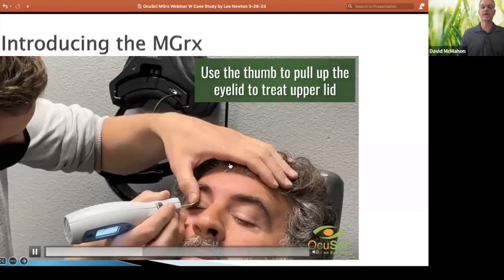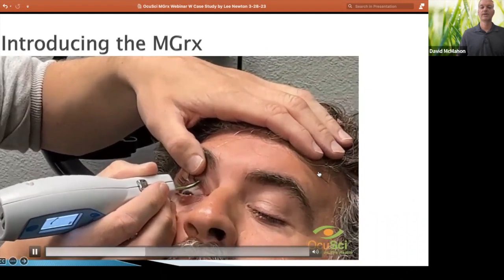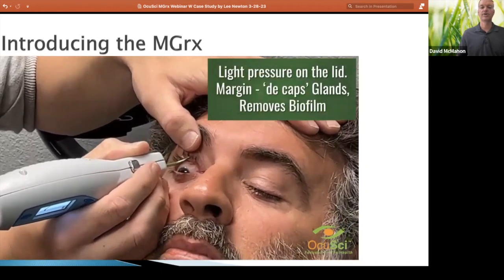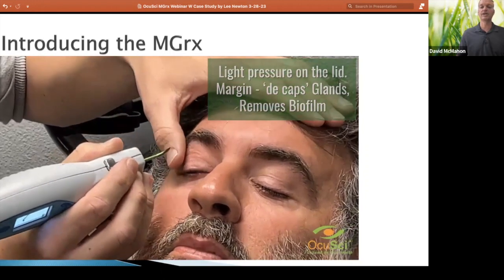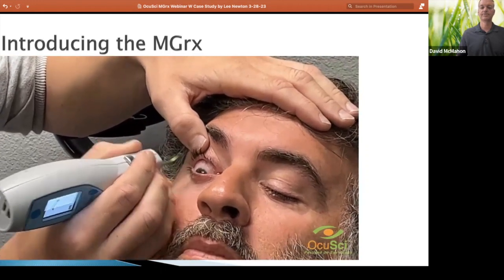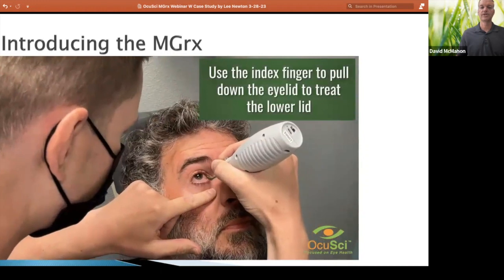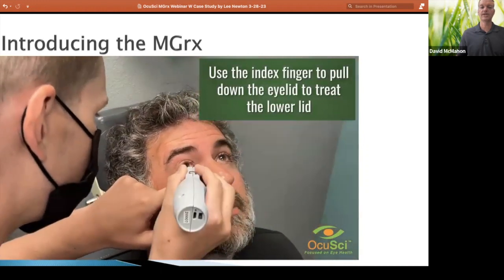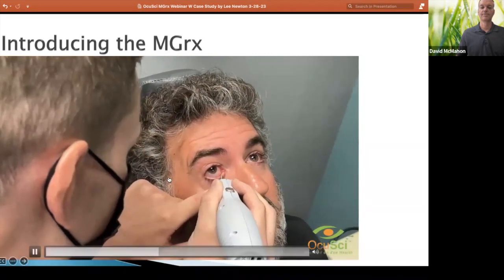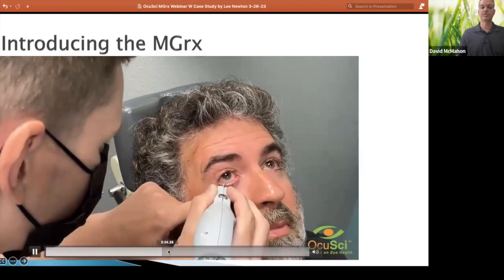What you just saw there were some anesthetic drops for this treatment. You can see he's just using light pressure and scraping off the biofilm and decapping those glands. He's pulling down the lower lid now — pretty easy access there. The temperature of that instrument is 42°C.